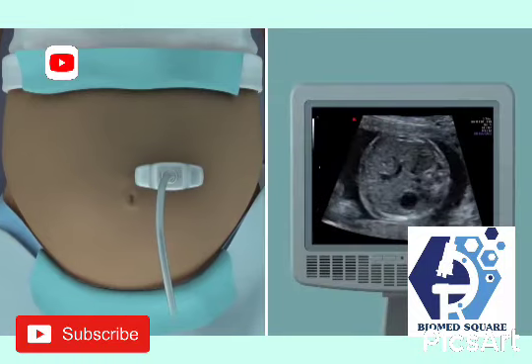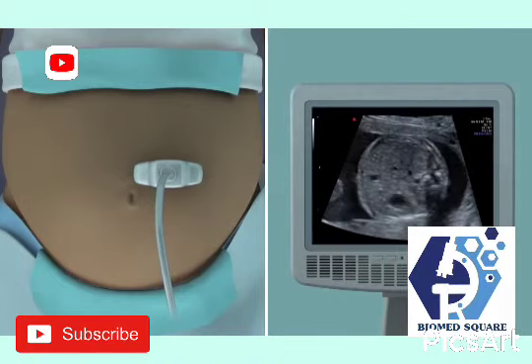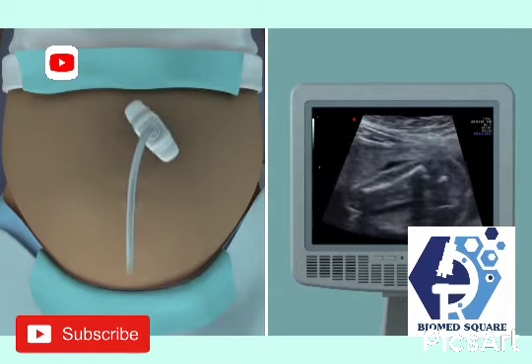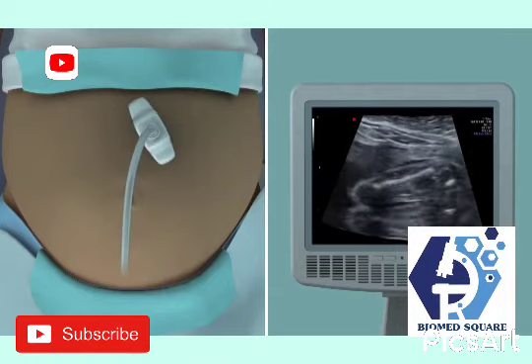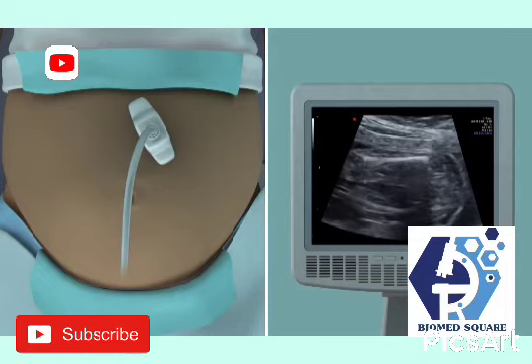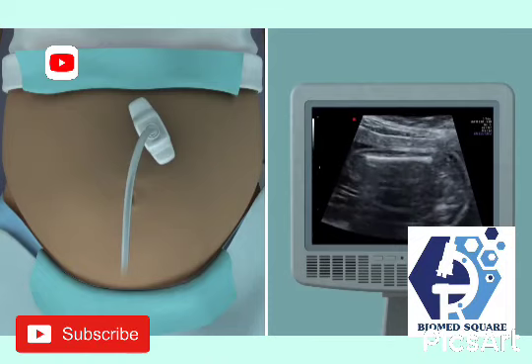Maintaining a transverse section of the fetal body, slide the probe down from plane 11 towards the fetal pelvis and rotate it to view a longitudinal section of the femur. This technique will prevent you from accidentally measuring the humerus.